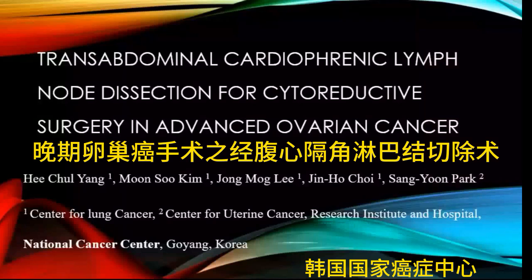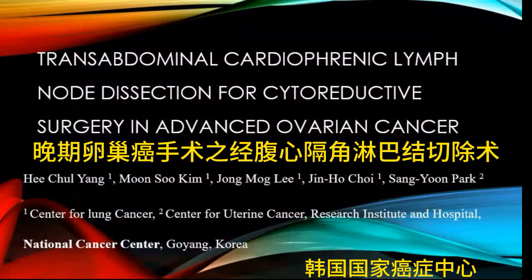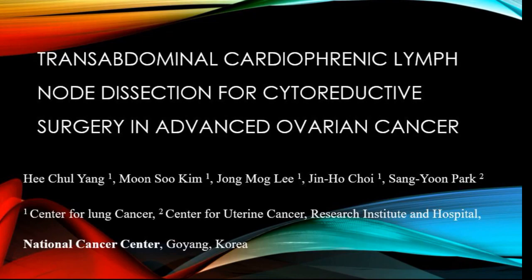This video will show the surgical technique of transabdominal cardiophrenic lymph node dissection for cytoreductive surgery in advanced ovarian cancer. Informed consent was waived by the Institutional Review Board for follow-up loss.